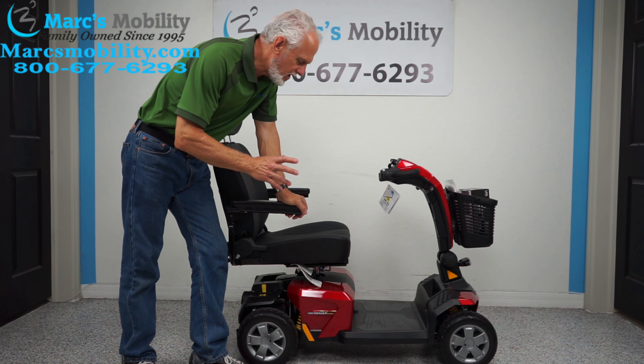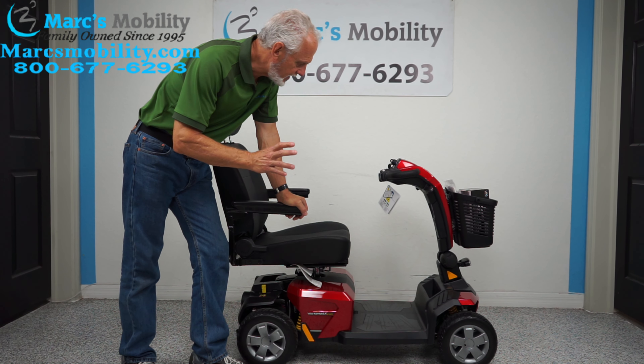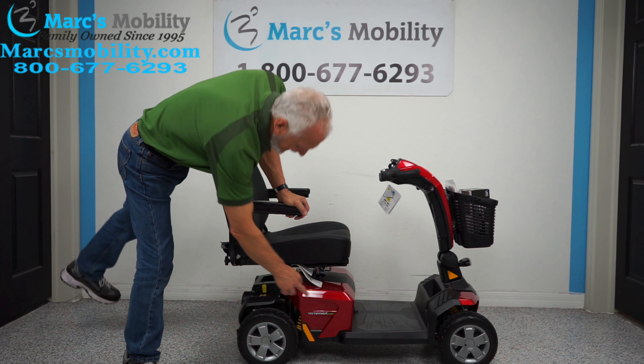We're going to give you a quick little demonstration on how to change the battery in a Pride Victory LX Sport.